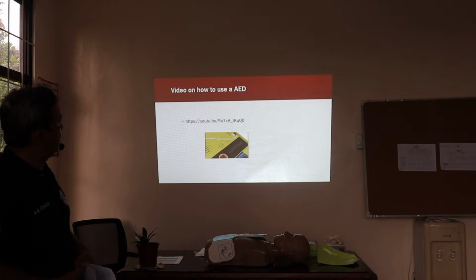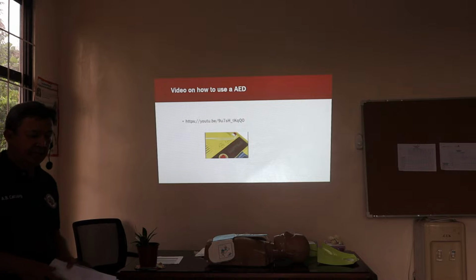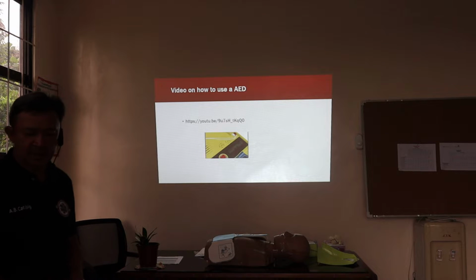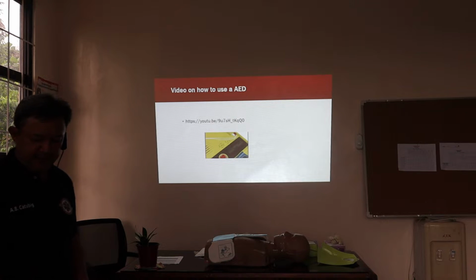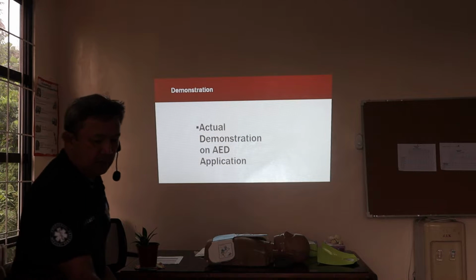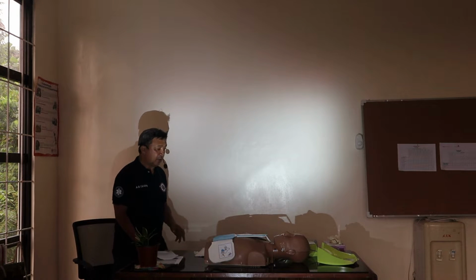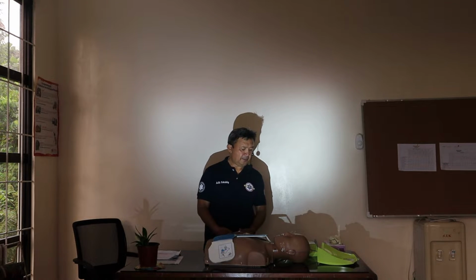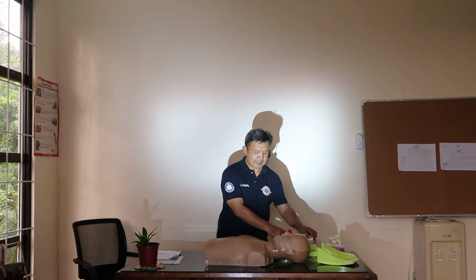Okay, so now I will show you a video presentation on how to use AED. Just watch. Okay, you're already done. So let's go now to the actual demonstration on AED application. With all the equipment already here, everything is already prepared, and the AED is in place.